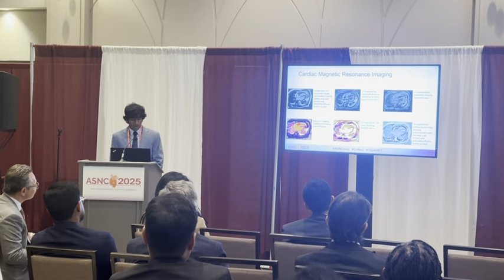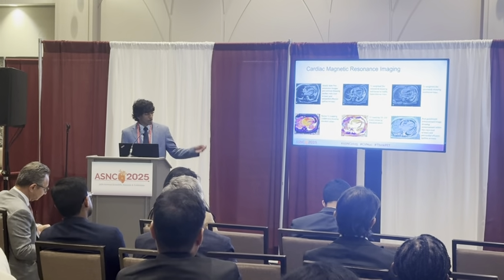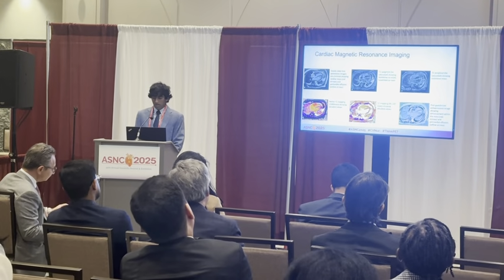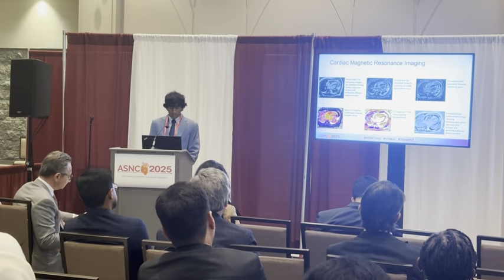Next was cardiac MRI. The image on the top left is an SSFP image, pre-contrast, showing cardiac mass with the red arrows and pericardial effusion, again with the yellow arrows. The two images to the right of that are T2 weighted and T1 weighted images, showing isointense to mildly hyperintense mass and isointense mass respectively.